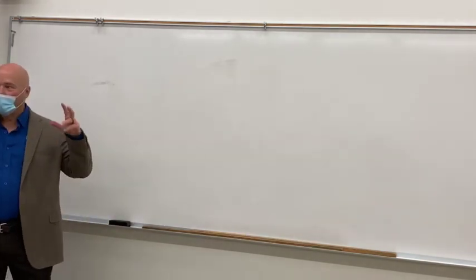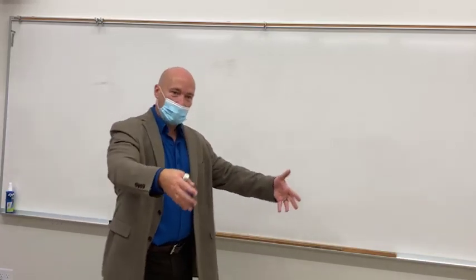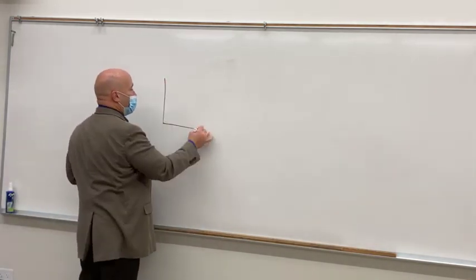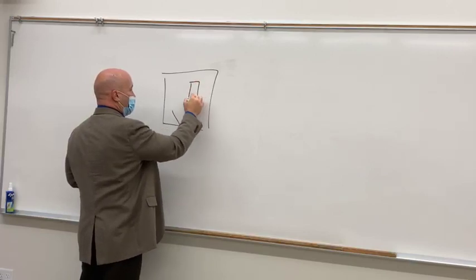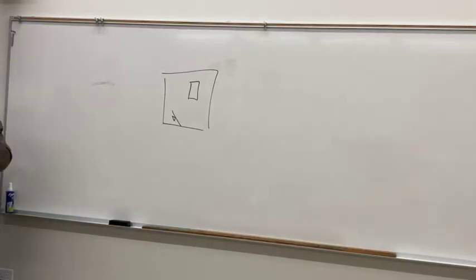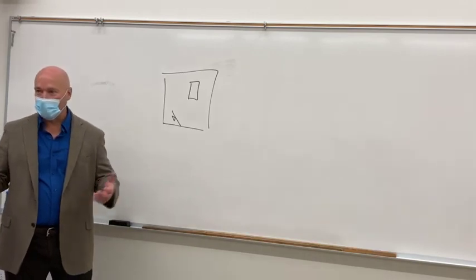It's still technically in the room, but it's not in the room. You know what I mean? It's not out in the area of exposure, but it's still in the x-ray room. So you've got an x-ray room, and you've got a table here, and your console is going to be back here. In a mammo room, if you've ever been in one, mammo rooms are tiny. They're like a closet.